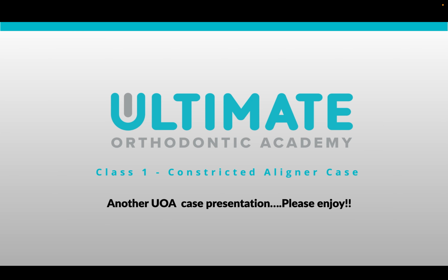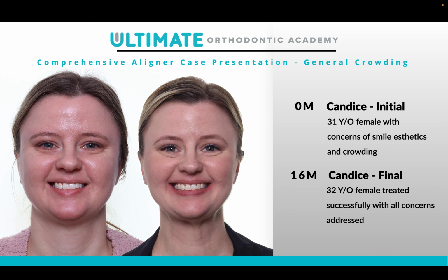All right, this is a class 1 constricted aligner case. Let's get into it and have some fun. So Candace came to us. She didn't want braces. She wanted all the attributes of what we present with arch development with our Damon Ultimate cases, and we had a solution for her.